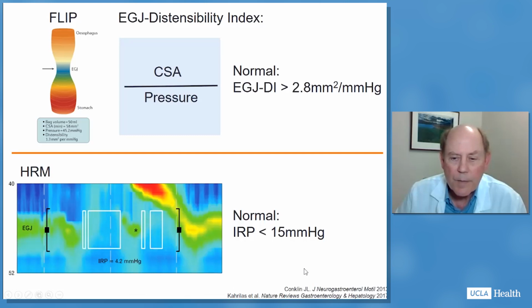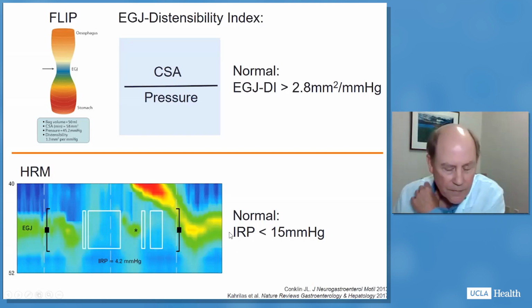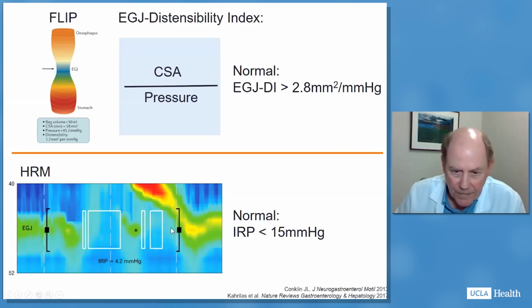Here is something you're probably pretty familiar with. This is the measurement of the integrated relaxation pressure or residual pressure at the esophagogastric junction. We don't need to go into how that is derived, but normal is less than 15 millimeters of mercury. Now, this perhaps is the worst metric in the Chicago classification. We see lots of people who have normal esophageal function and a minimally or mildly elevated residual pressure at the EG junction. And the question then always becomes, is that a real thing or not?